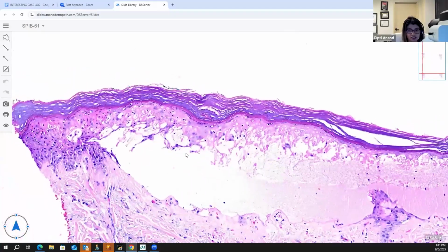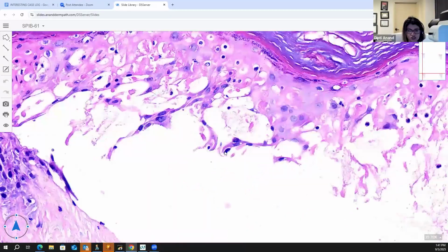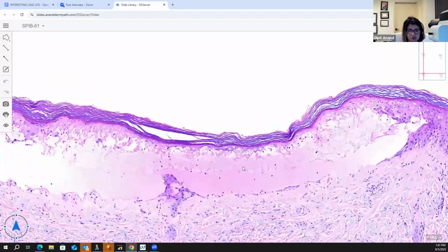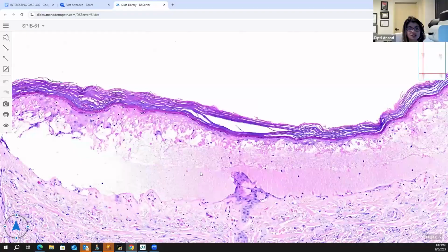It's not ballooning reticular degeneration just for the reason I said, because of the interface change. And the reason it is not ORF is, where is the rest of the epi gone in here? In ballooning degeneration, you do see dermal edema, but the prominent feature is the whole epi becoming swollen and necrotic and getting dead.